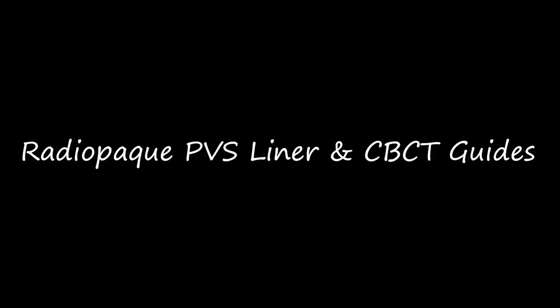Hello everyone, this is Dr. Michael Scheer with LearnLodi, a free resource on how to market, treatment plan, place, and maintain locator overdenture implants. This video, we're going to describe a radiopaque PVS liner and CBCT guide technique to utilize everyday and commonly available CBCT scanning software to fabricate everything we need to have a computerized surgical guide designed and then executed clinically.